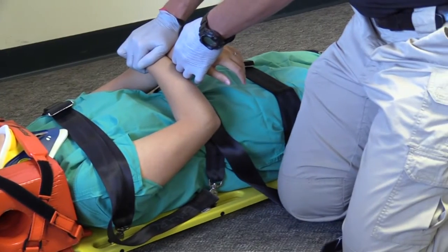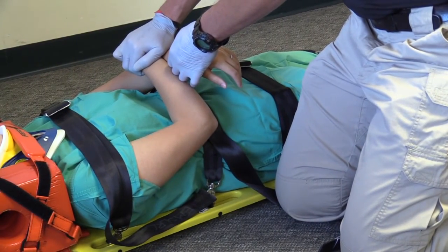Finally, I will reassess pulse, motor response, and sensation in the patient's extremities.